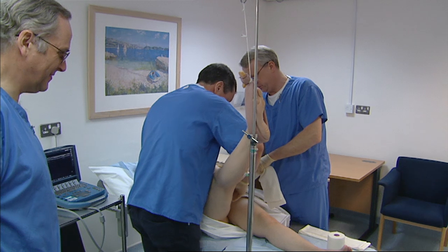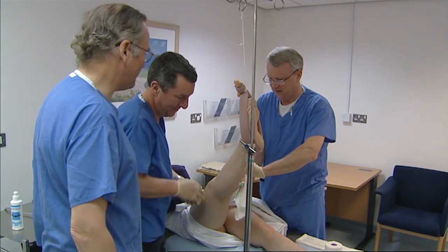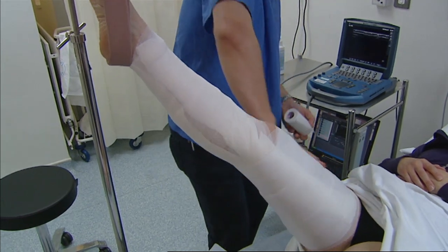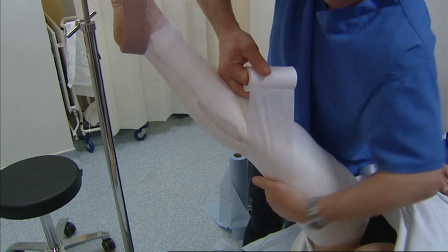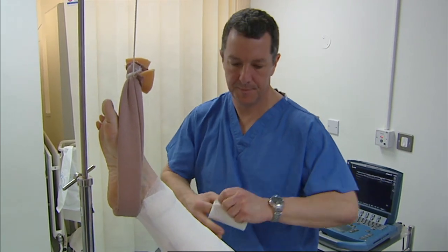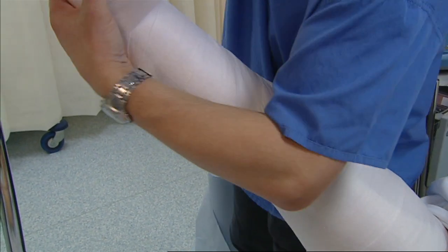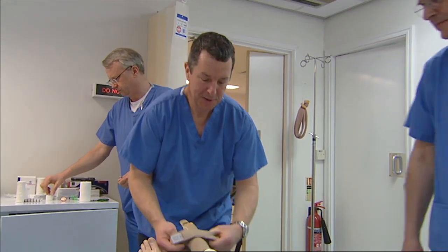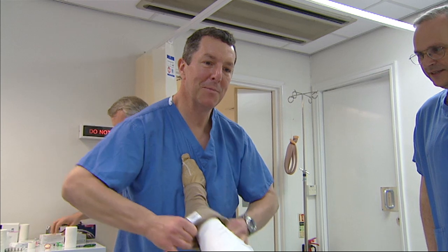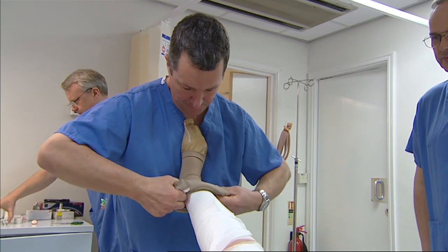After foam sclerotherapy, blood is trapped within the vein as thrombus. If we don't apply enough compression to the leg, we get a very large amount of thrombus, which produces considerable pain, discomfort, and even thrombophlebitis afterwards. So putting a firm compression bandage on and leaving it there for five to seven days is a very important part of avoiding that complication. There's a range of opinion as to how much compression should be used, but this style of compression fits under most people's clothes very easily. We found that it avoids the tender lumps that some patients get after their treatment, and we now regard this as a pretty essential part of the management of veins by foam sclerotherapy.